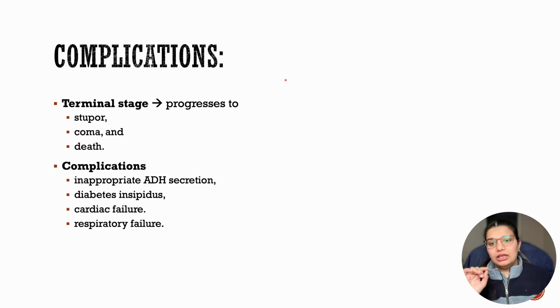Talking in summary, rabies. Points to remember: it's transmitted from the bite of a rabid animal. It replicates either towards the central nervous system or away to the peripheral tissues, presenting as common symptoms. On H&E, we see Negri bodies within the cerebellar Purkinje cells, or Lyssa bodies. Babes nodules can be seen. And then some other findings like perivascular cuffing, leptomeningeal involvement, and neuronophagia. On IHC, a rabies antigen stain highlights it, and it's more sensitive and specific as compared to H&E. So this is all of our discussion today.